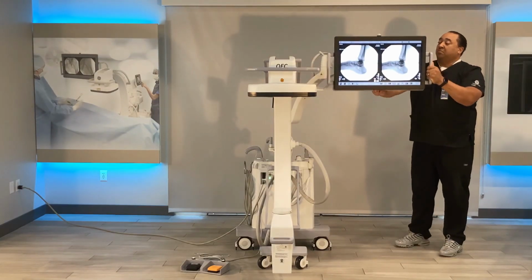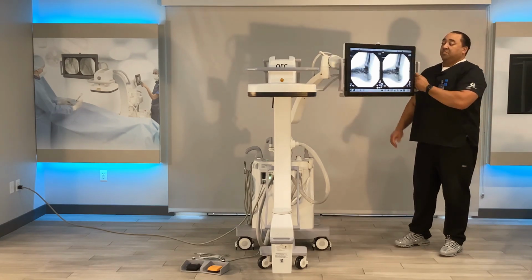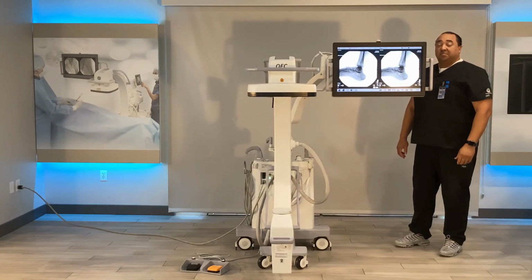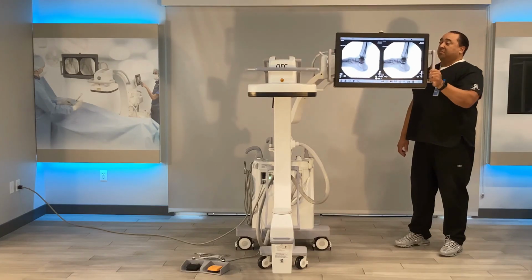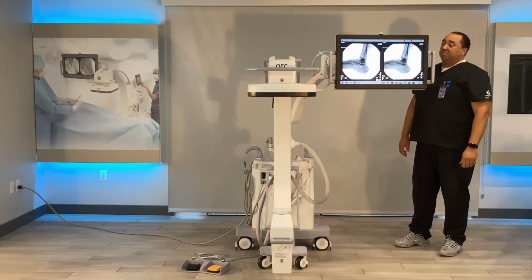There is 210 degrees of swivel at the mainframe and 180 degrees of swivel at the center arm. The monitor has up and down or vertical travel of 40 centimeters. 180 degree image display monitor swivel, and even a 5 degree or 25 degree downward tilt.